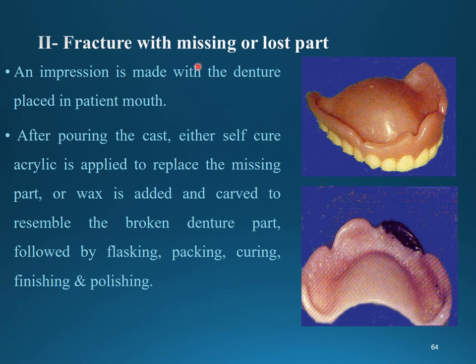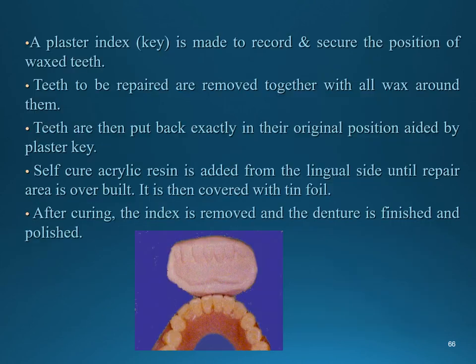For a fracture with a missing or lost part: an impression is made with the denture placed in the patient's mouth. After pouring the cast, either self-cure acrylic is applied to the missing area or wax is added and carved to reassemble the broken denture part. The whole thing is then flasked, packed, cured, finished, and polished.